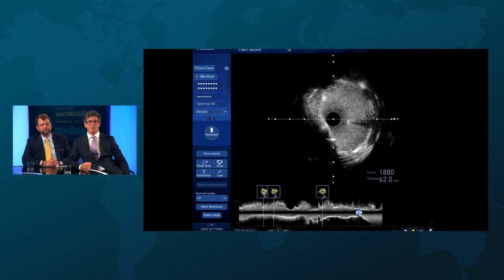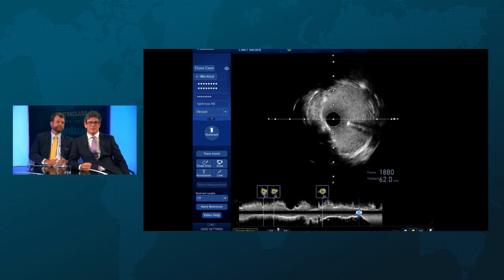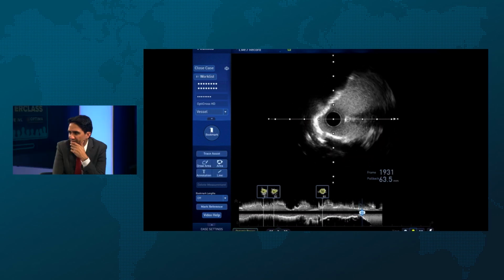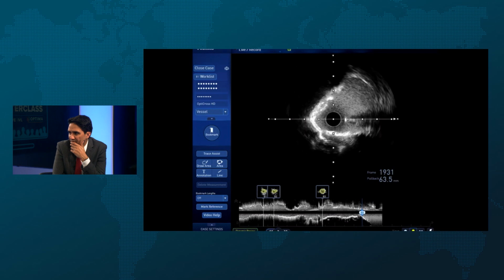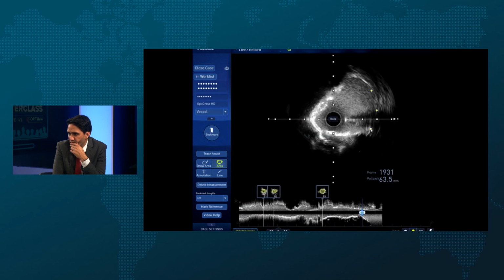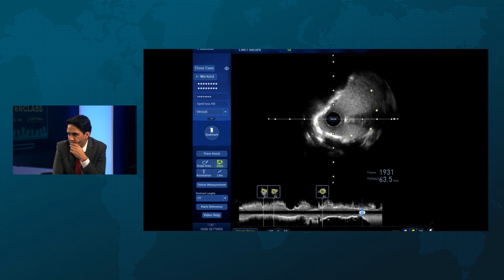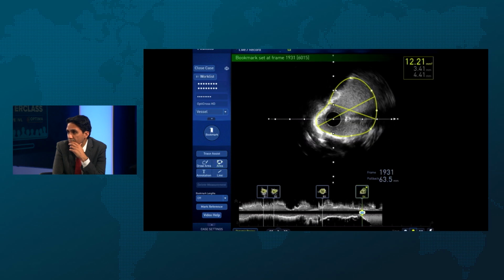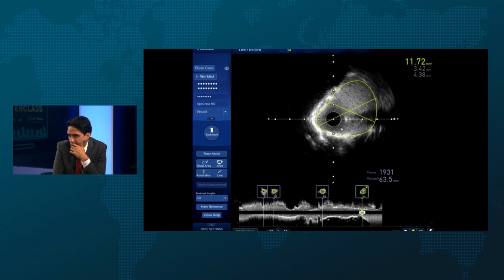It's just again gonna be another D-shaped stent, but it looks good, very good area. Yeah, I think it's pretty good. That's pretty respectable. Beautiful. Well done. Somewhere around about 11.5, 12.